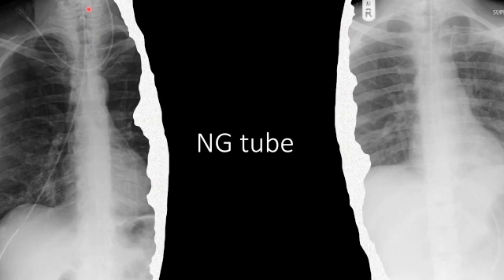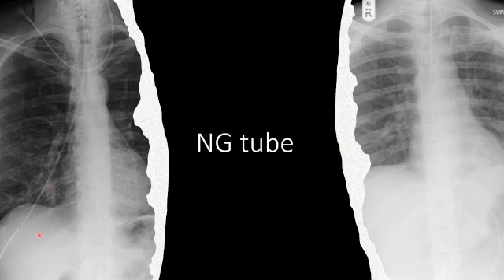This image shows a misplaced enteric tube — specifically a feeding tube. You can tell it's a feeding tube and not a suction tube because the tip is markedly radiopaque; that's a weighted tip feeding tube. This tube actually headed down through the right main bronchus into the right lower lobe. If you look at an appropriately placed tube, it goes down the midline and never follows the course of any bronchi.